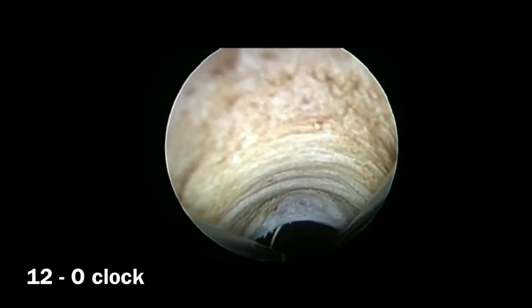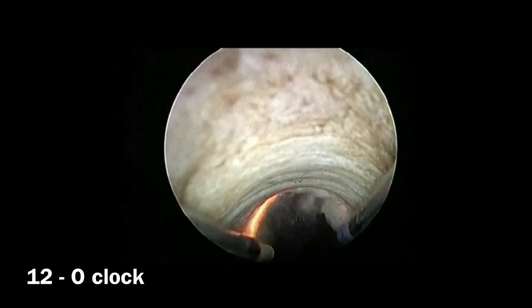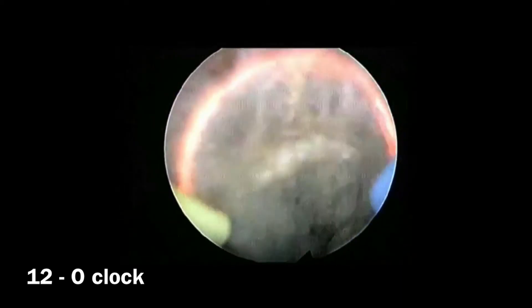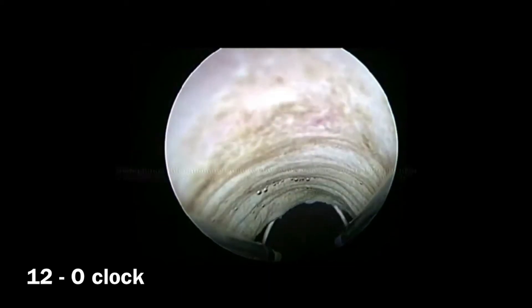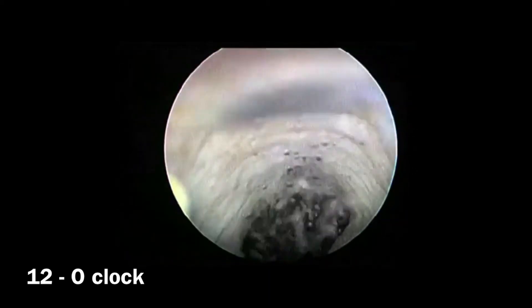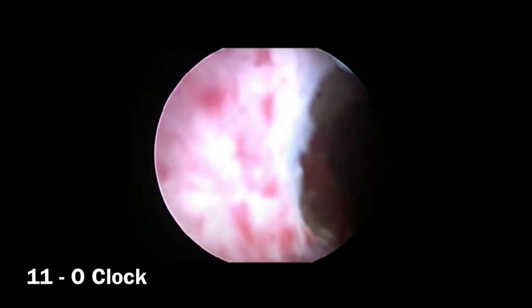The resection is done until the circular fibers are seen. As the circular fibers are seen, the resection is stopped and proceeded along the 11 o'clock position. Here, one can make out the circular fibers being visible.